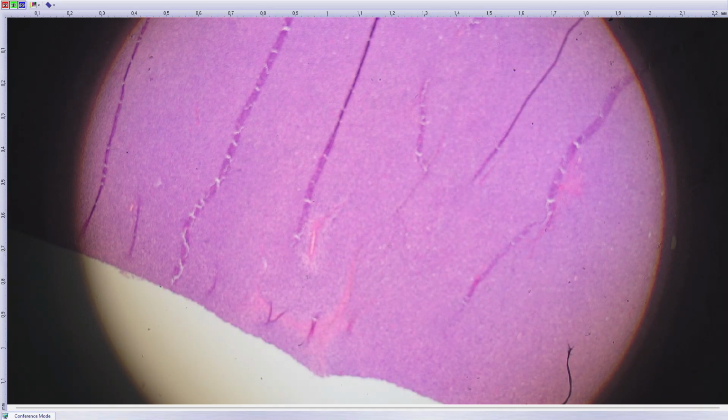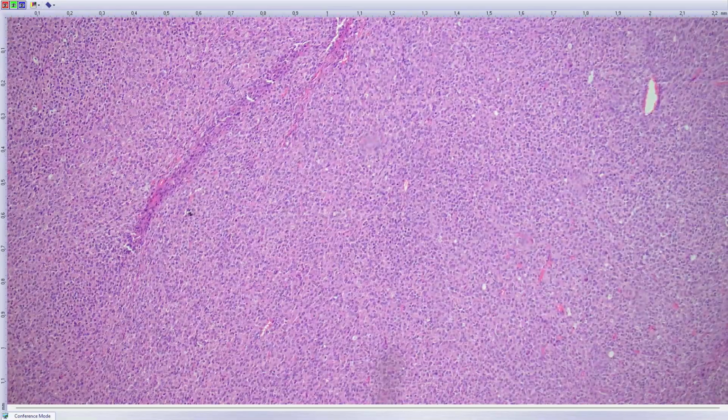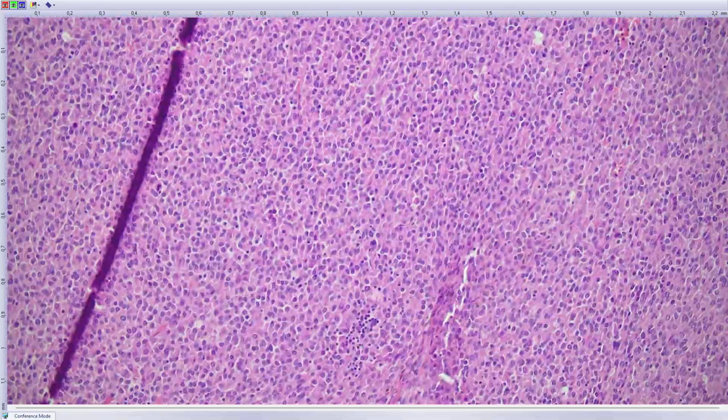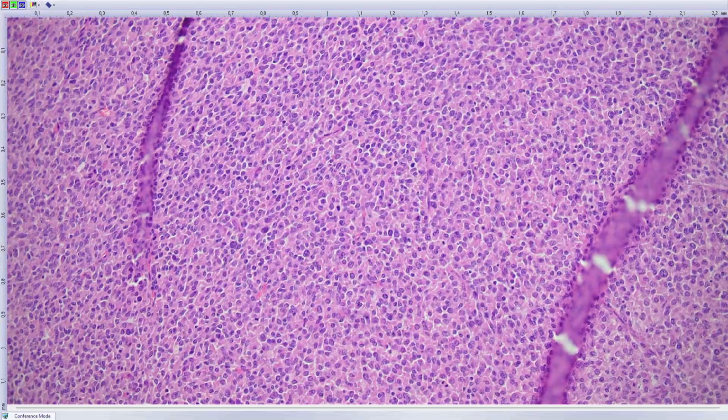Okay, next case. That's a fascinating lesion. It's a tumor of the stomach. The lady was 63 years old. It's from 2019. Back then she was 63 years old, and this was her tumor in the stomach. It was diagnosed here. So relatively monotonous spindle to epithelioid neoplasm, lot of mitotic activity. There was necrosis, so obviously something malignant.